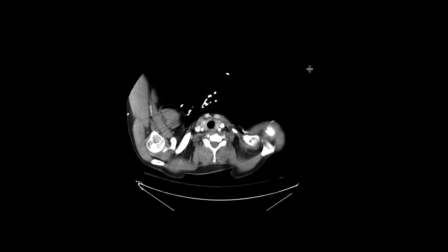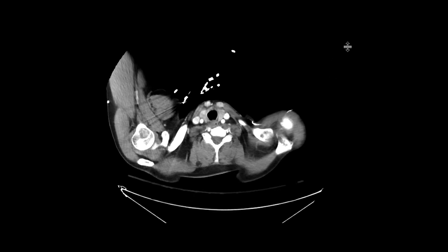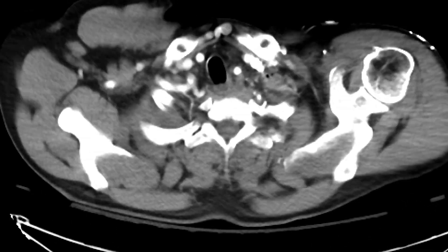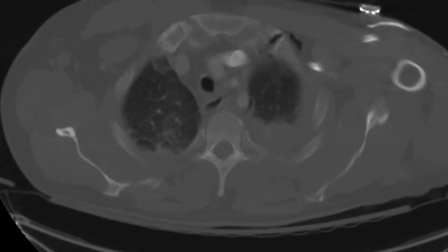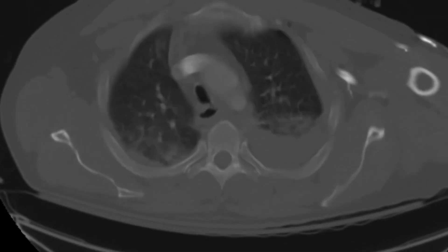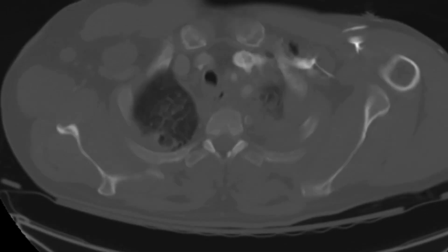This is a patient who sustained a significant fall, and a trauma CT chest, abdomen, pelvis is obtained to look for injuries. As we scroll through this, I'll start with the bone windows.